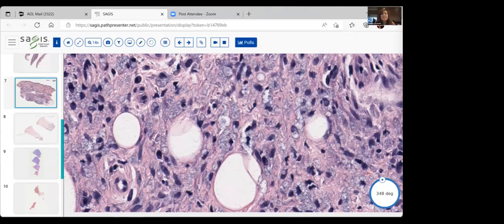You can see that in a regular H&E, the bacteria will just look blue-gray, unfortunately. To see the outline of the acid-fast bacilli that you would see in Hansen's, you have to do your Fite stain, and then you can see the red bacilli. But in H&E, it's just going to look like this blue-gray, and these are globi.